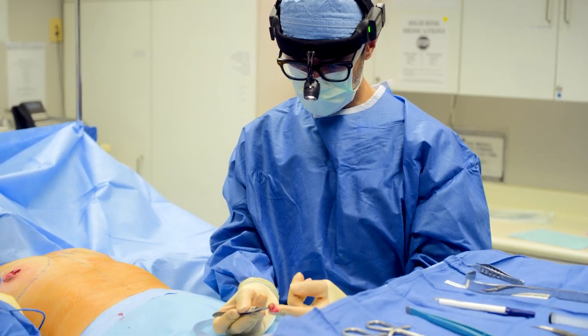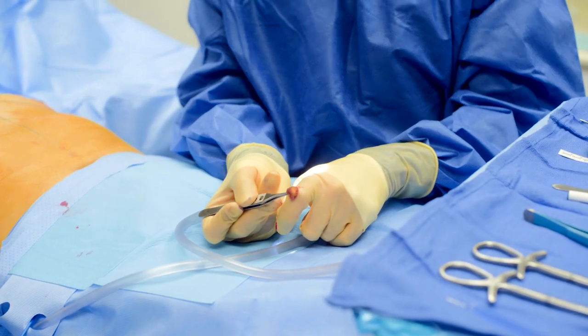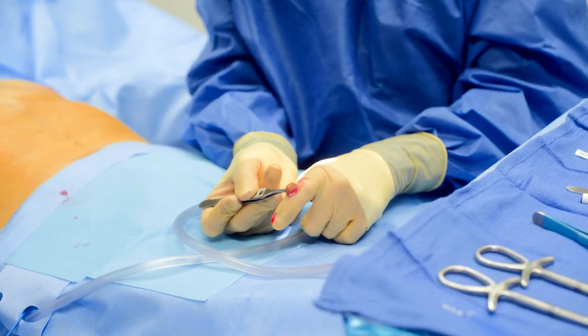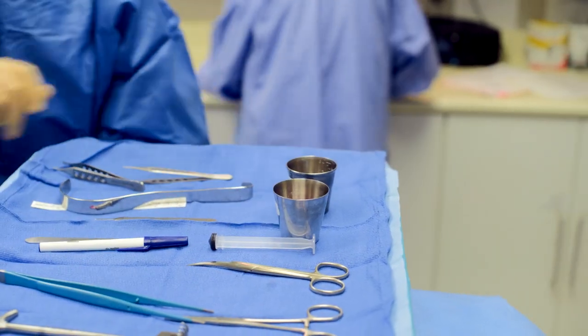This here is the nipple from the left side, and I'm going to make it much smaller at the end of the surgery to use as a free nipple graft. So I'm going to put this in its appropriate container for now and come back to it at the end of the surgery.